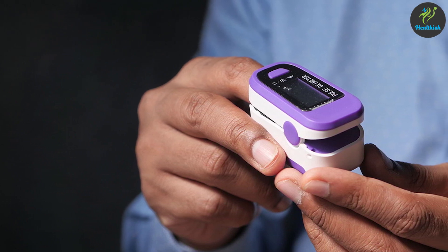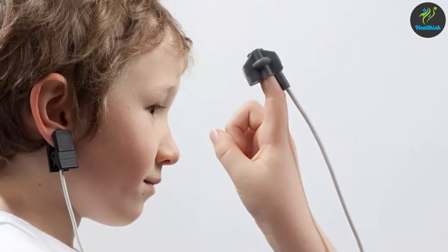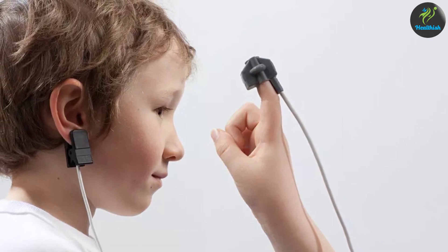Let's discuss the applications and suitability of ear and finger pulse oximeters. Finger pulse oximeters are versatile and suitable for a wide range of individuals including adults, children, and the elderly. Ear pulse oximeters, although less commonly used, may be preferred in certain situations such as for patients with limited finger mobility or when finger measurements are challenging.